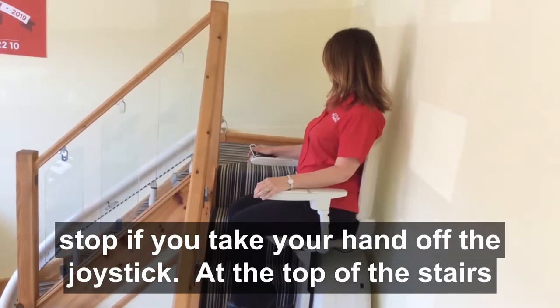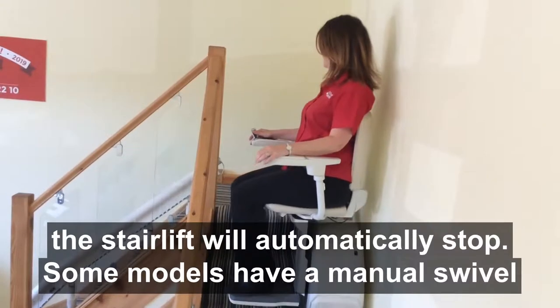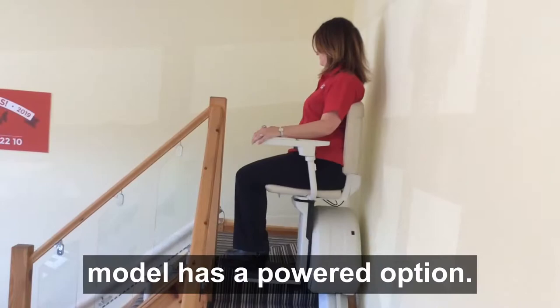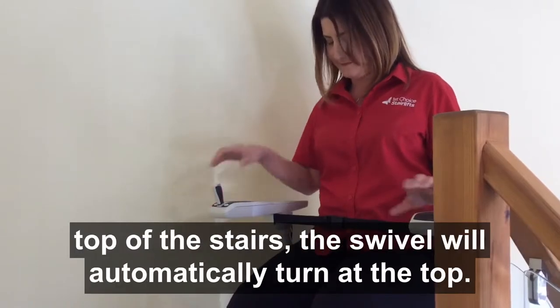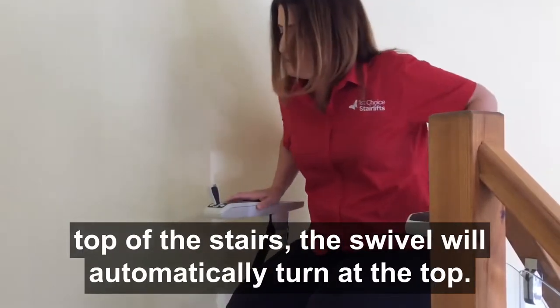At the top of the stairs, the stairlift will automatically stop. Some models have a manual swivel seat which turns the chair at the top of the stairs. This particular model has a powered option, so by keeping constant pressure on the joystick when you get to the top of the stairs, the swivel will automatically turn at the top.